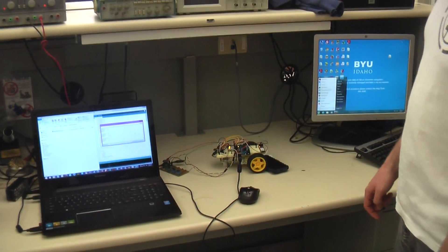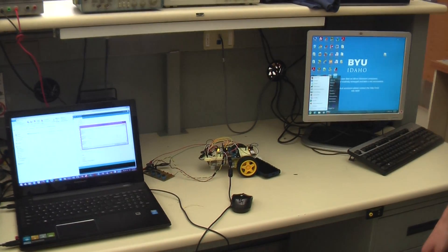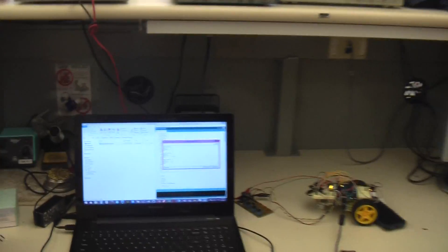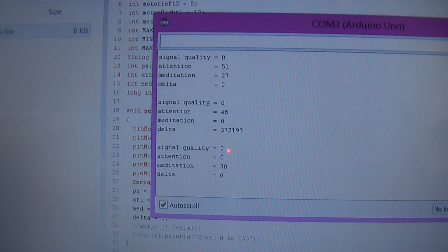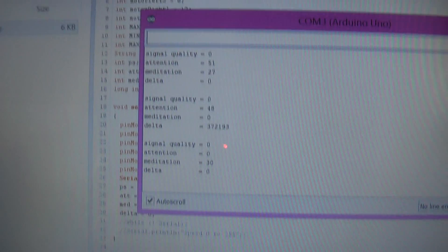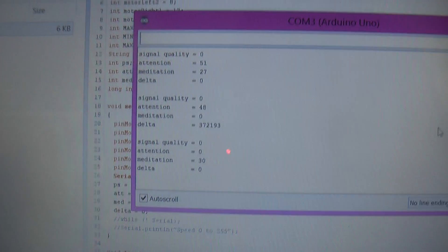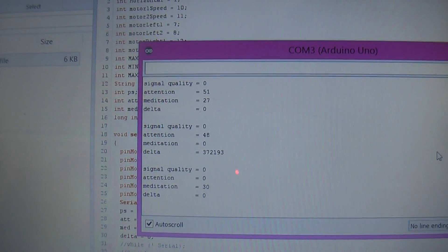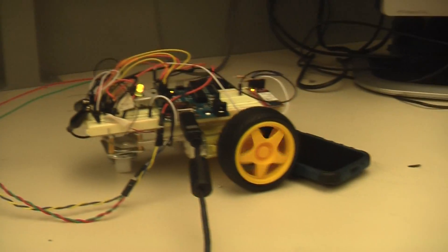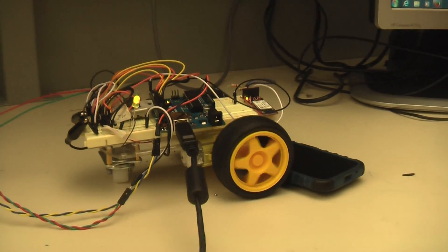Steven, make it go. Now, it's going to be slightly difficult to see, but this is a printout that the Arduino is doing in real time of the various attention levels and data that the headset is sending. When the attention gets to a specified threshold, as you can see, the wheels will roll.